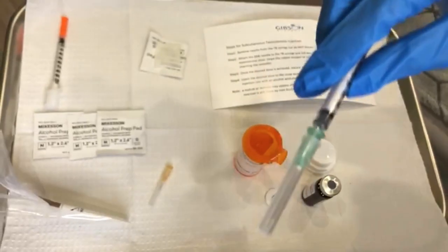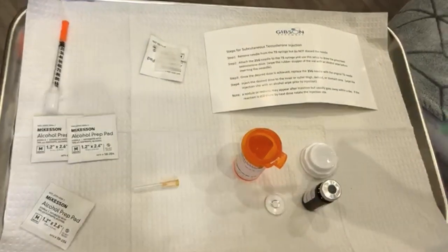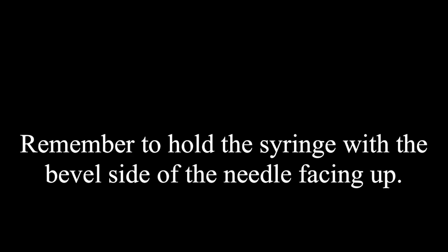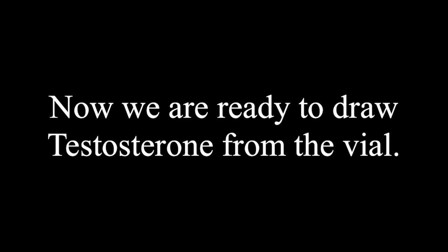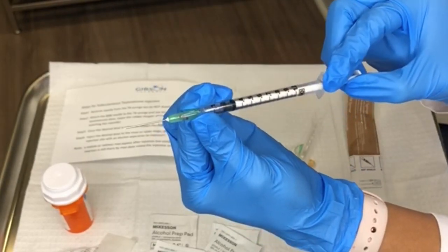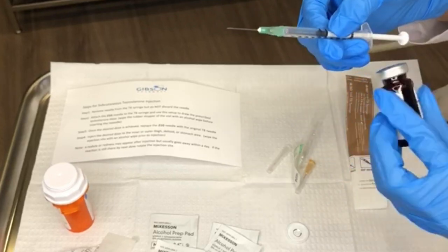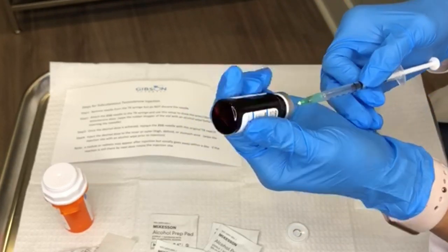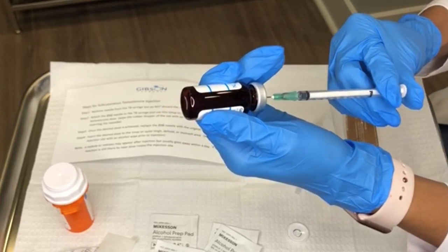As you attach it, screw it on and remember that at this point you need to consider your dosage amount. We're using 0.5 ml for the purpose of this video. Pull the plunger of the syringe back to the 0.5 ml line to fill the syringe with air — this prevents a vacuum effect from occurring. Insert the needle bevel side up and push the air into the vial. If you push too little air you'll find it hard to draw out the medicine, and if you put too much air the medication may be forced out of the syringe.